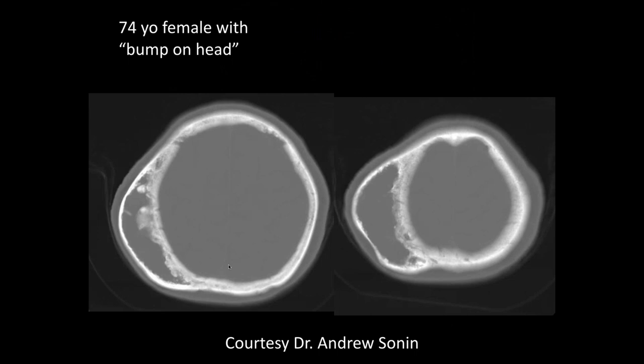A 74-year-old female with a bump on the head. So there's an expansile lesion in the frontal parietal convexity, sort of extending outward. There's like a bony matrix partially within the lesion. Very irregular, like some thickened trabecular bone. Yeah, there's some hyperostosis there.